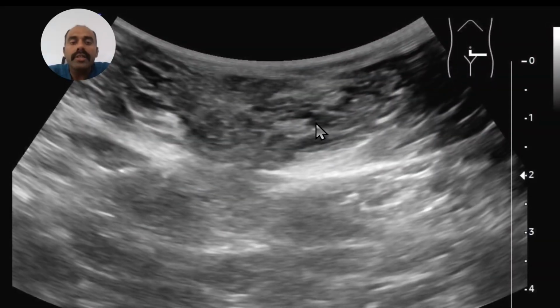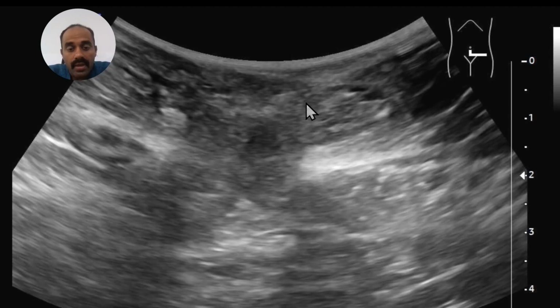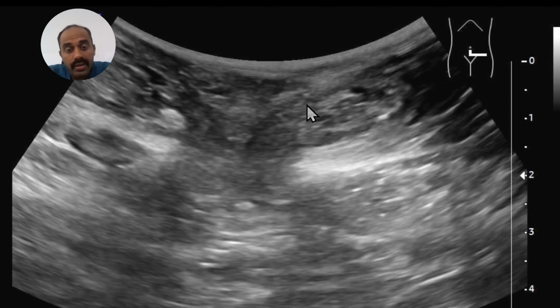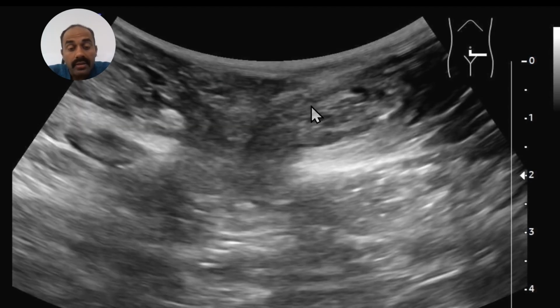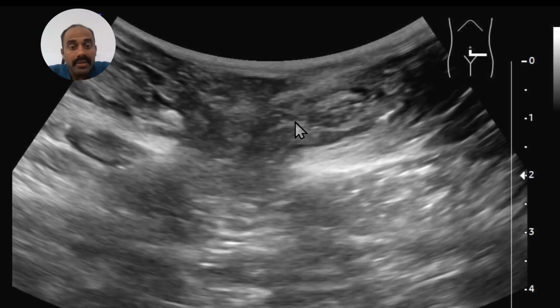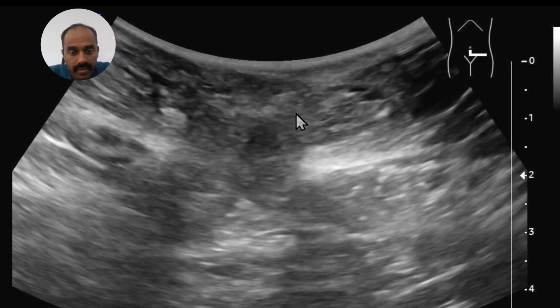The typical content that usually herniates in an umbilicus is the peritoneal fat, mesenteric fat, omental fat, and this can at times get strangulated, limiting the movement of bowel within, and at times you can even have bowel herniating directly into the subcutaneous plane.